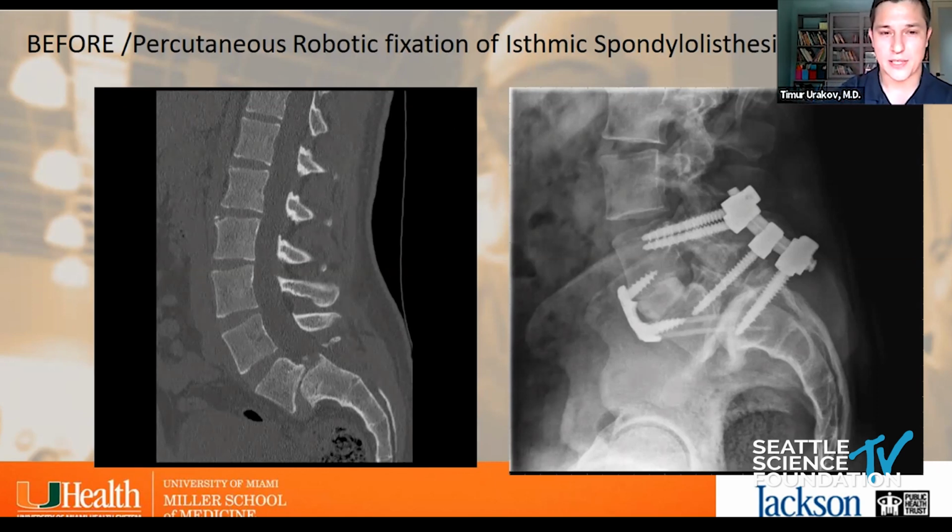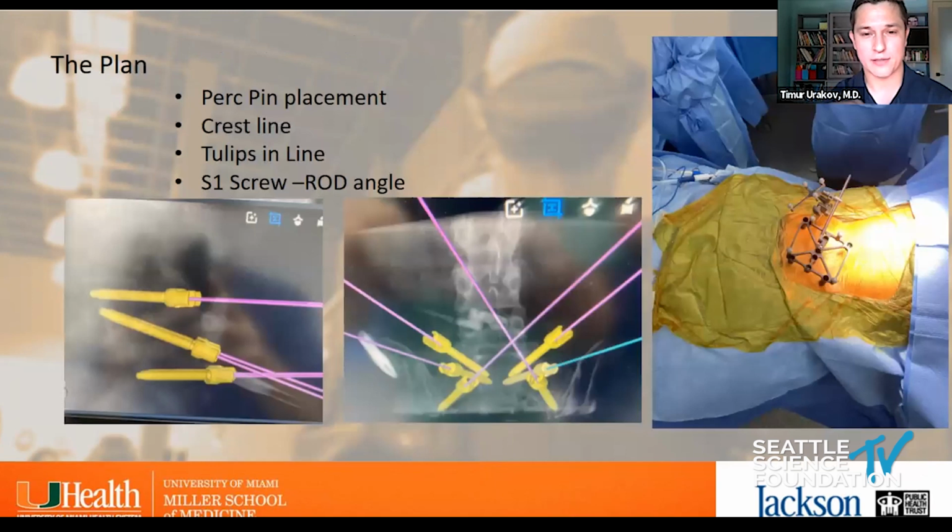With the robotic system, I have been trying this now, and we actually have a combined case series with Dr. Nicholas Theodore. He's been doing this as well. When we discussed it, we kind of serendipitously found out that we've been separately doing this. So now we just have to collect a little more time and see, and hope that they don't fail. And if they don't, it'll be great.